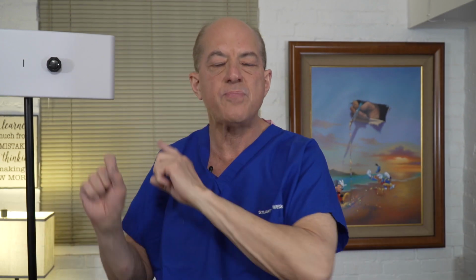So passive systems are thermal cameras, infrared cameras that scan big, wide populations of people. So as I go past this, the camera zeroes in on my face, it recognizes I'm a human face, and it then measures my temperature. Right, and some of the sophisticated artificial intelligence systems can measure many people walking through an airport, and it looks at their temperature. One of the downfalls of a passive screening system like that, which doesn't require any human intervention, is that it measures the difference in infrared temperature between the person and the surroundings, which makes these types of systems difficult to use in outdoor venues.